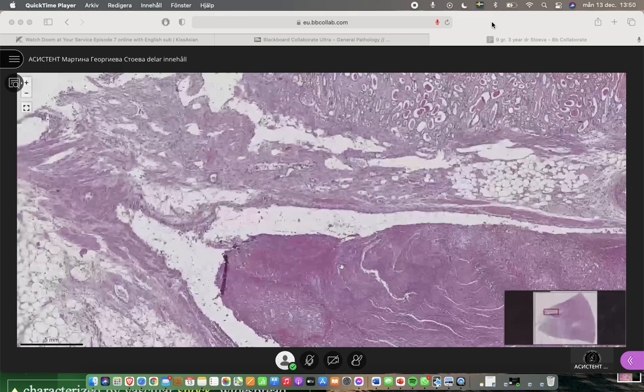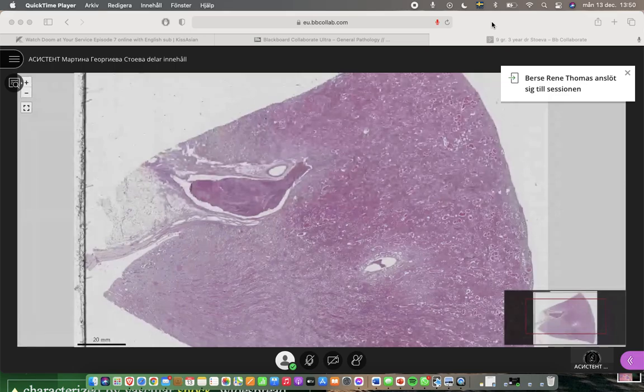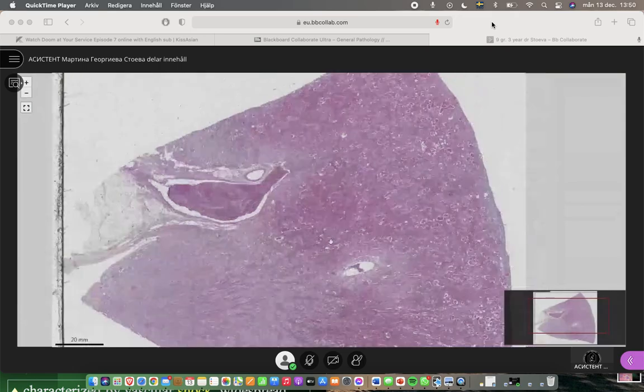Because if you mention it, then the discussion may take the road to thrombi formation, Virchow's triad, where could it be formed, where could it come from, and so on and so on. So your situation will become more complicated than it is, I think. Of course, if you're asked, you should answer what you see here in the blood vessel.